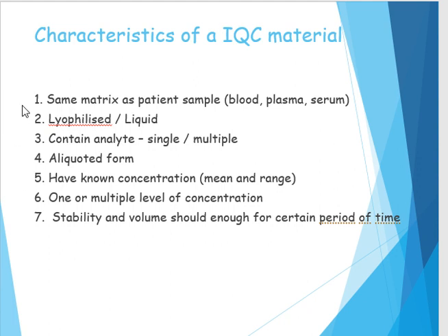Yes, same matrix as patient sample, lyophilized or liquid form, containing analyte either single or multiple, in aliquoted form, having known concentration that is mean and range, one or multiple levels of concentration, and stability and volume should be enough for a certain period of time. Okay, let's go through one by one.